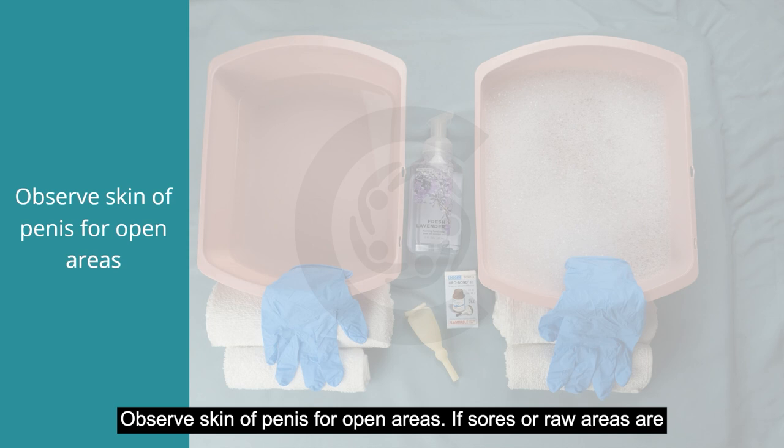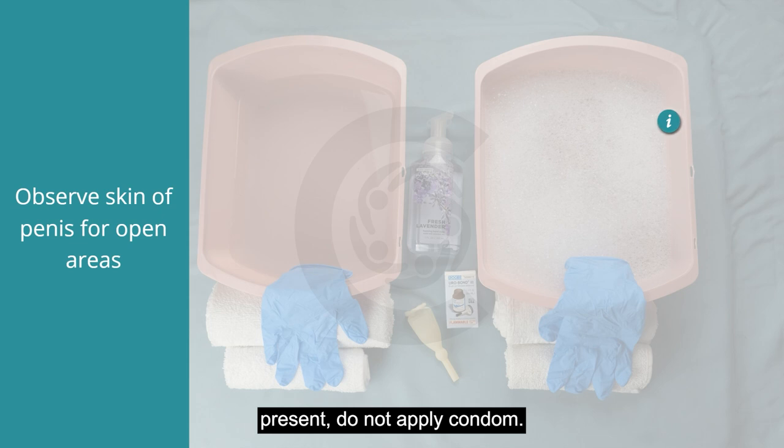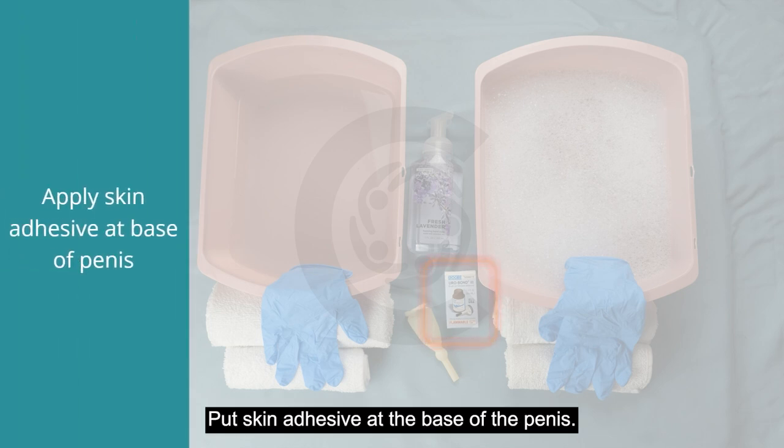Observe and scan the penis for open areas. If sores or raw areas are present, do not apply the condom catheter. Apply skin adhesive at the base of the penis.